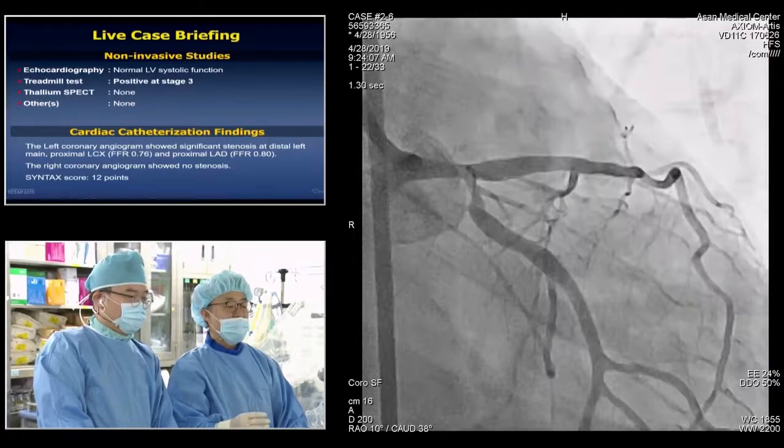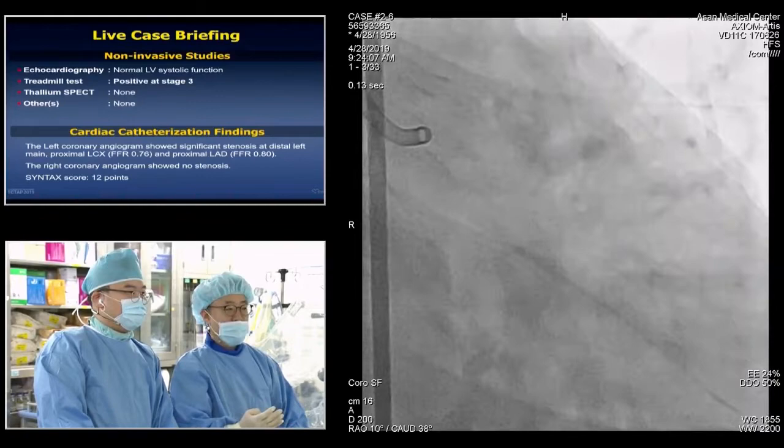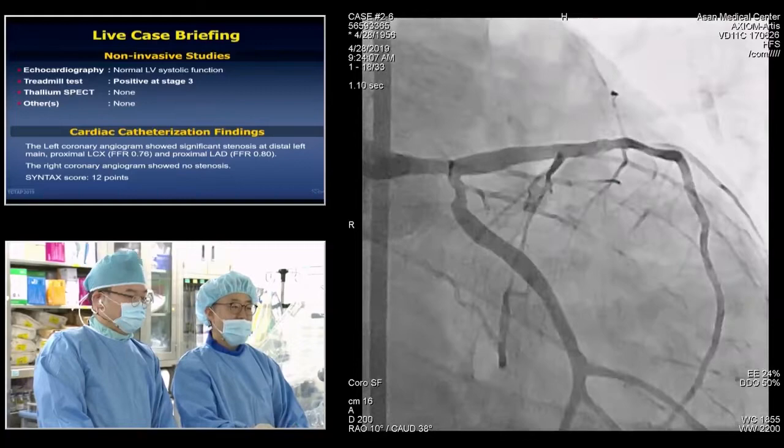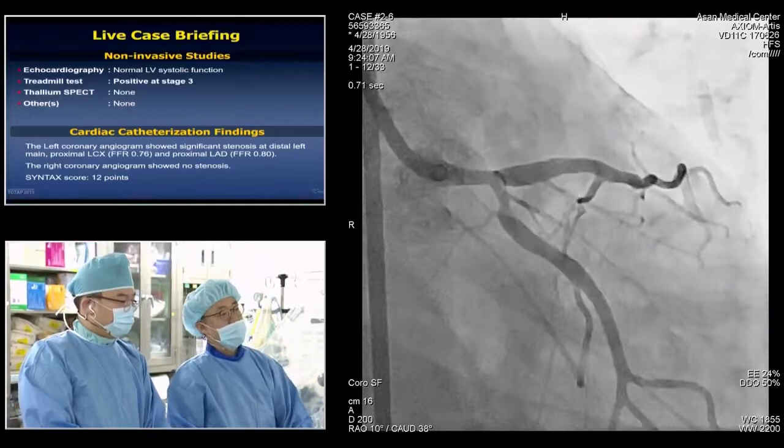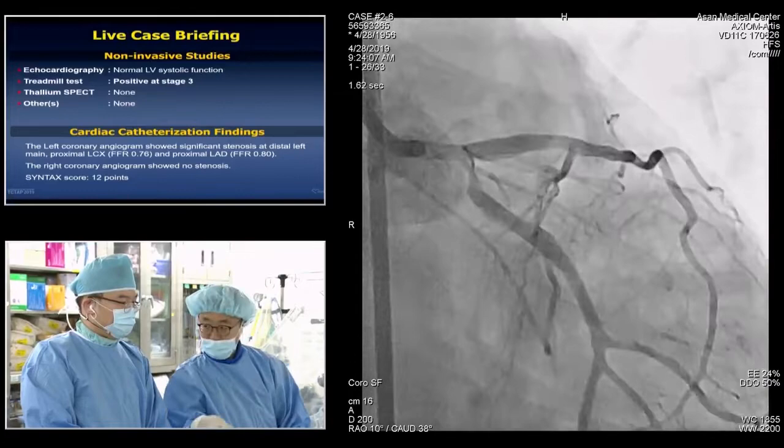There is a lot of debate about which treatment strategy is best for such a relatively young patient with distal main disease. Any comments or discussion from the panel for such a patient? So I'd like to ask David Taggart. We have a very outspoken cardiac surgeon on our panel who worked with us on EXCEL and many other trials. David, do you have any problem with us doing PCI on this lesion?